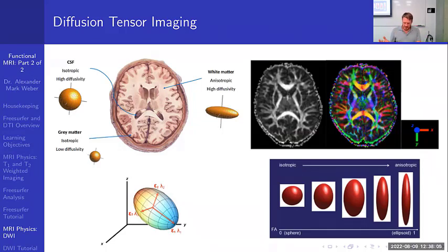So while diffusion weighted imaging refers to the contrast of the acquired images, DTI is a specific type of modeling of the diffusion weighted data sets. And there's many other models, and they're all fighting to be the right one and give specific information. So the basic concept behind DTI is that water molecules diffuse differently along tissues depending on its type, integrity, architecture, and presence of barriers, giving information about its orientation and quantitative anisotropy.